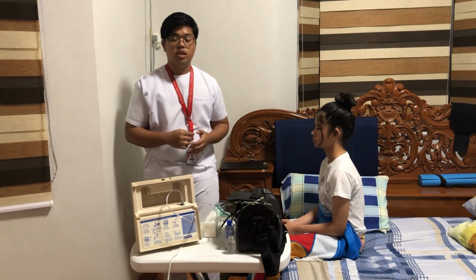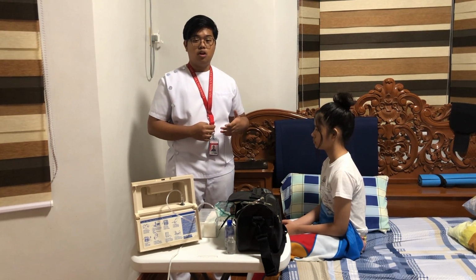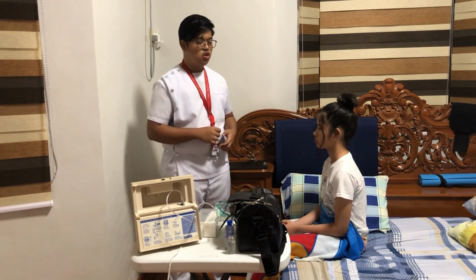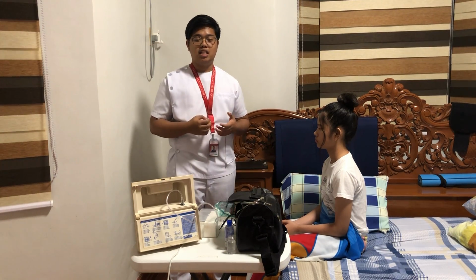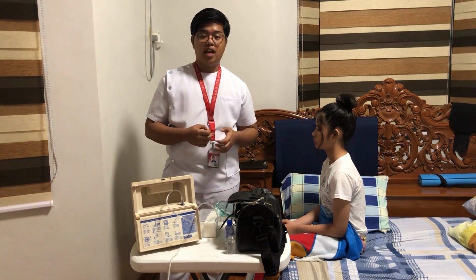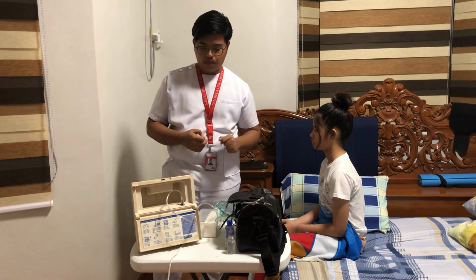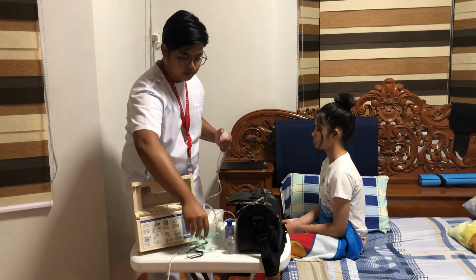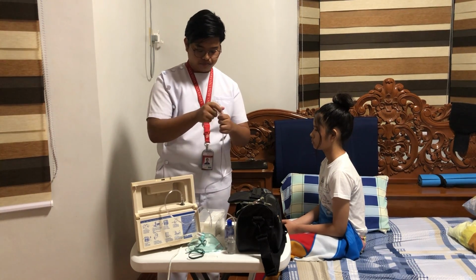So the next thing that we need to do is to encourage the patient to cough and expectorate, or suction any mucus formation as necessary. And then also we need to assist our patient with oral care, and then we also need to clean and change the nebulizer cup and tubing as appropriate, and it is essential in the process of preventing any bacteria buildup. So we're going to clean this one. We need to disassemble and put it aside in order for us to clean it later.